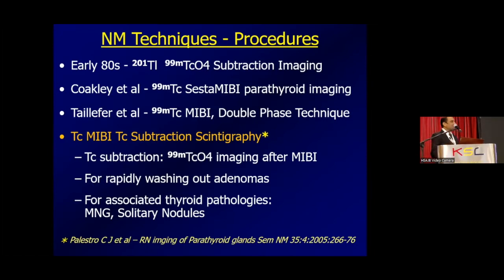That's where sestamibi came into the picture, and Taillefer, a nuclear medicine doctor who was then a resident in Canada, established and standardized the dual phase technique. The dual phase technique is a planar image. You take the neck and anterior chest image during the first initial time, immediately after the injection, then 2 hours delayed, the dual phase technique.